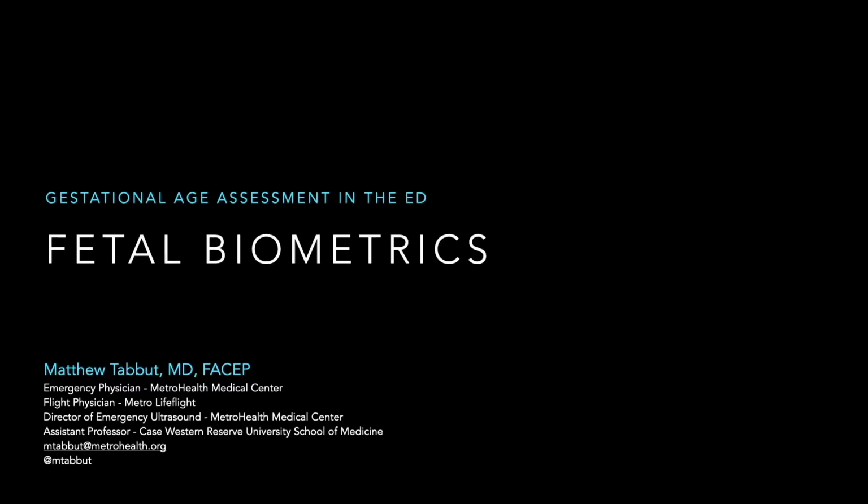And today we're going to hit a topic that really has some applicability in multiple different spheres of caring for pregnant women, and that's assessing how far along the patient is, right? How close to delivery we are, how advanced this fetus is, because there's a lot of implications clinically that will have for how we're going to approach and manage patients if we know how far along they are. So with that said, let's dive right into our topic today.